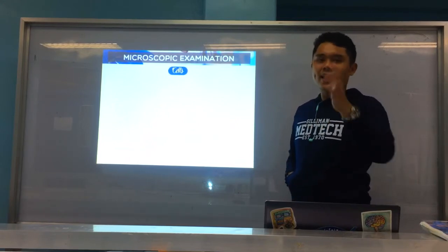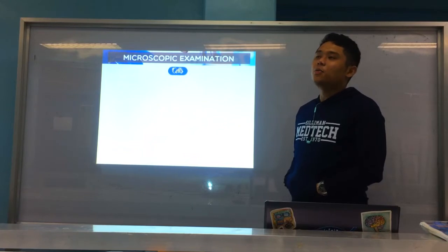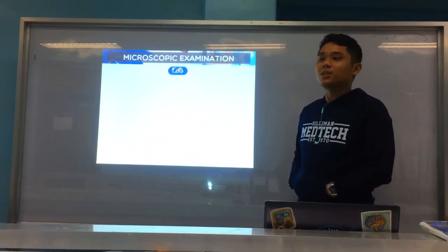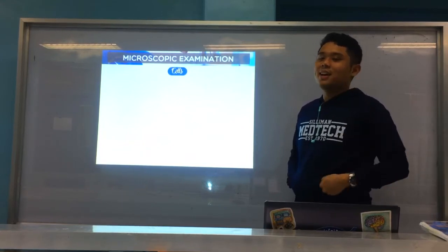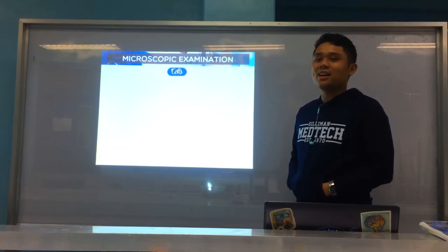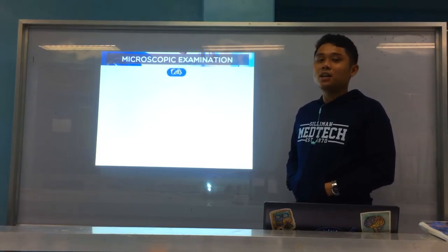Before that, again, these are the two dyes used for automated microscopy: phenanthridine and carbocyanine. Which one stains DNA, letter D? Phenanthridine. And carbocyanine is for mitochondria and other structures. What are the colors? Phenanthridine is orange, and carbocyanine is green.